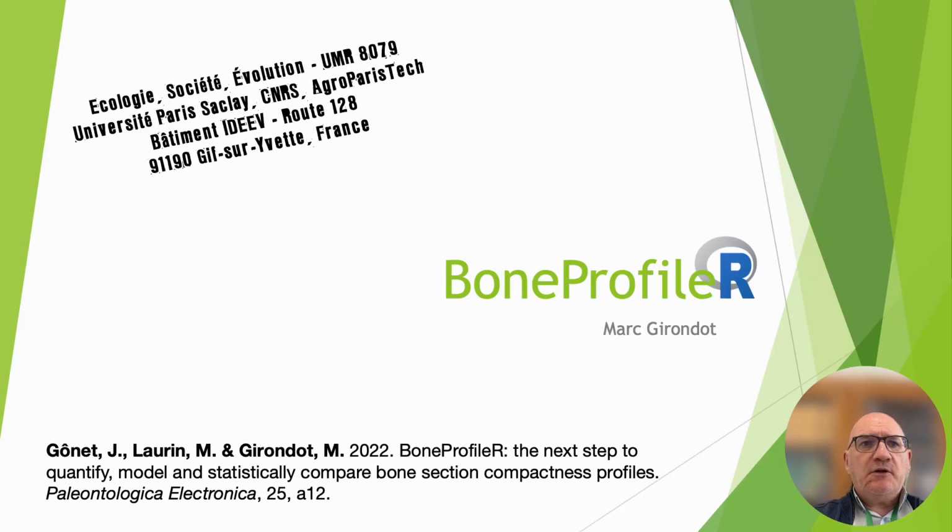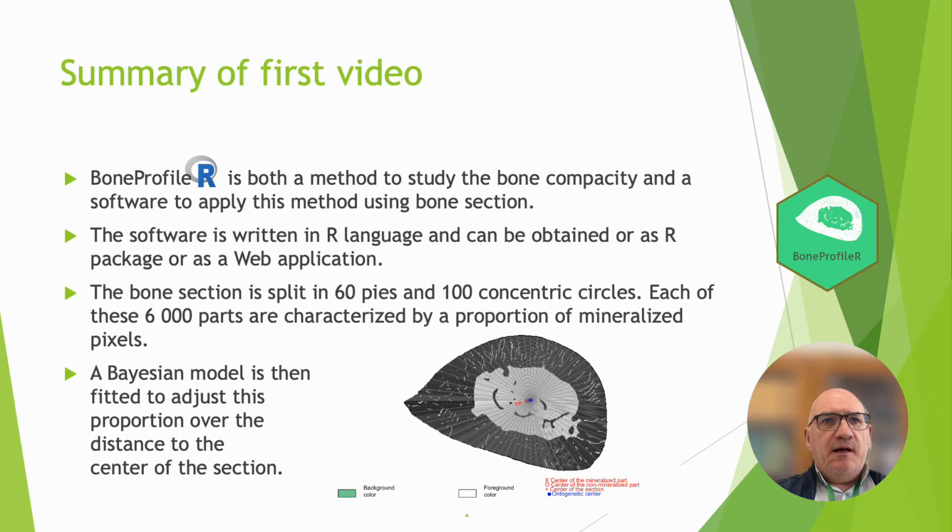Hi, we will continue to discuss the use of BoneProfileR. BoneProfileR is both a method to study the bone compacity and a software to apply this method using bone section. The software is written in R language, and can be obtained as an R package or as a web application.